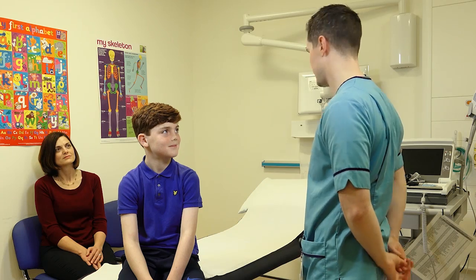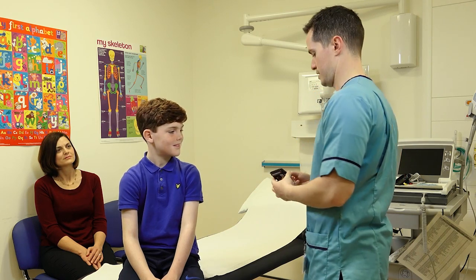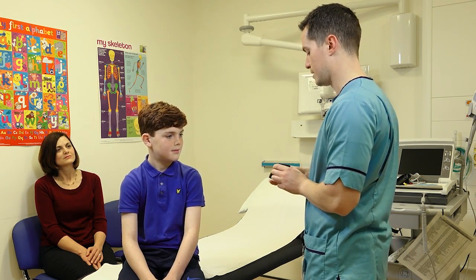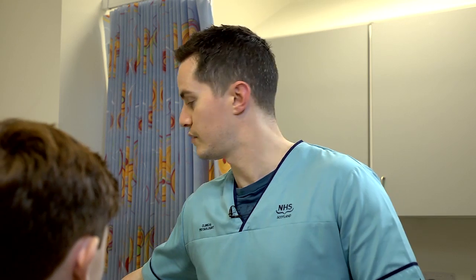Hello Sam, my name is Nick and I'm going to be fitting the ambulatory ECG to you today. It's a little monitor that looks like this. It's attached to your chest via some electrodes and basically what it does is it records your heart rate and rhythm for the next period of time.